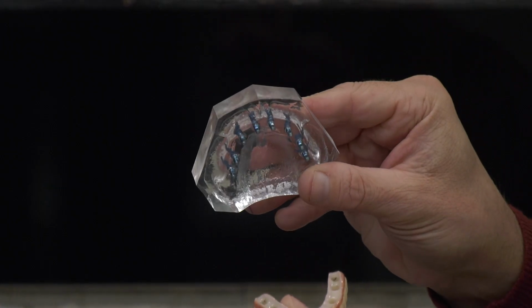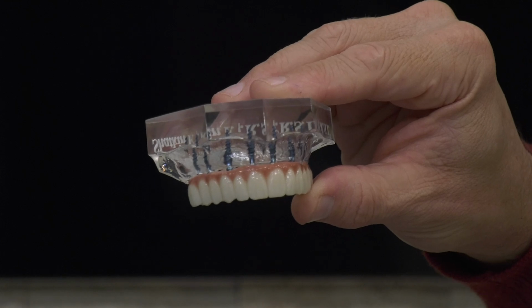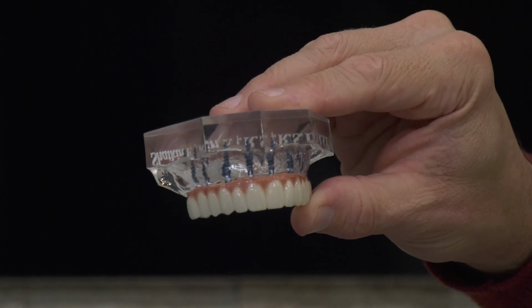We have the straight abutment on the mono implants, so it would be impossible to take an O-ring housing and snap it on that abutment. So what we do with this implant is we cement single teeth to it. We could do bridge work, and we can also do full zirconia, Xantex, or Allure restorations on the mono implant.